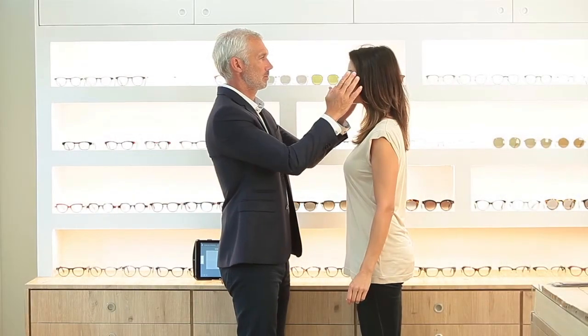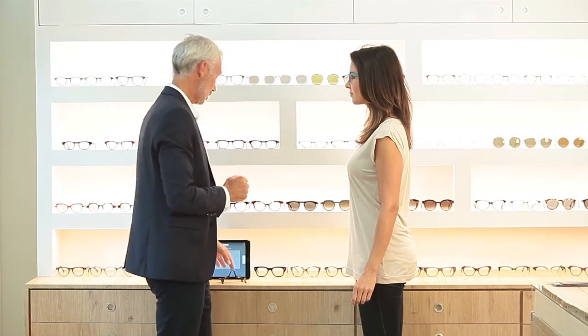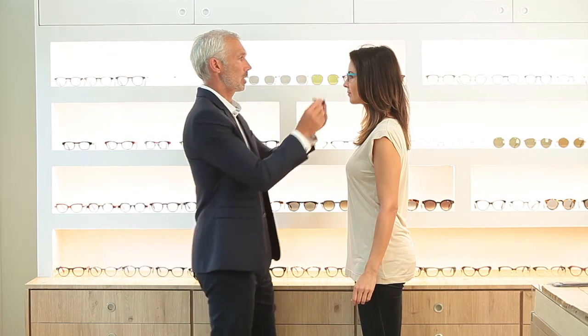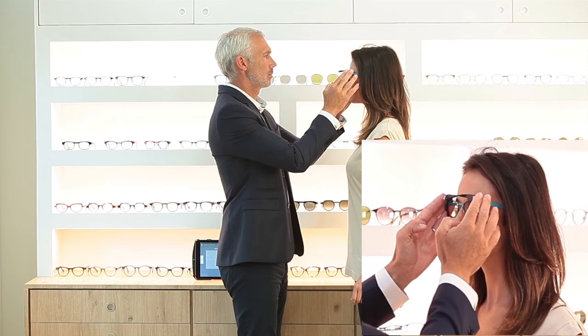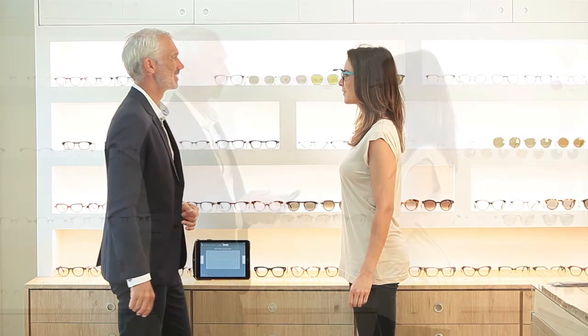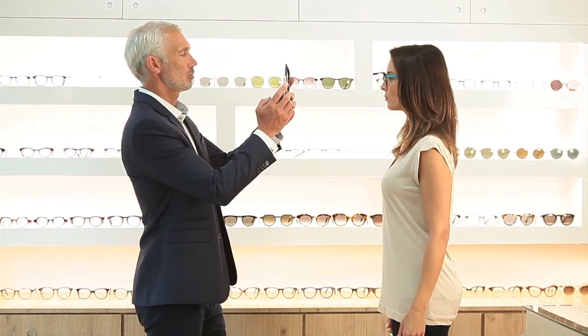Accurately fit the patient's actual new frame before measuring. Place the frame reference device, FRED, on the frame, making sure that FRED is as centered on the frame as possible. The patient posture should be as relaxed and natural as possible. Ideally, the head of the person being photographed should not be tilted up, down, or to the side.